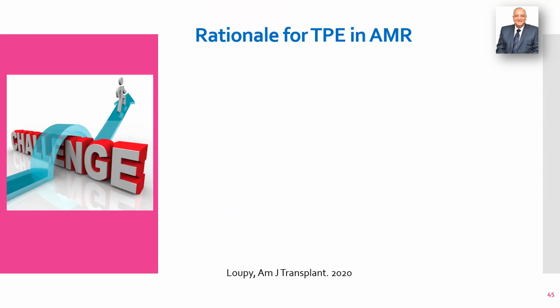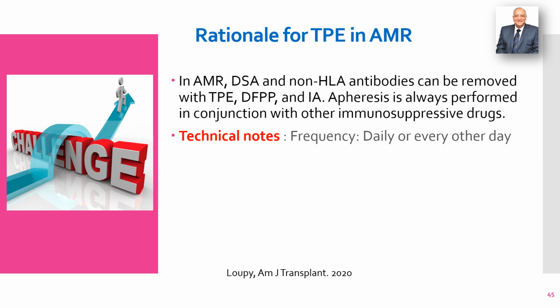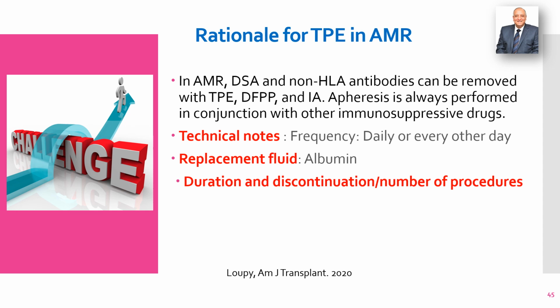Lastly, plasma exchange in antibody-mediated rejection. Both DSA and non-HLA antibodies can be removed with plasma exchange, double filtration, or immune adsorption. Apheresis is always performed in conjunction with other immunosuppressive drugs. It may be daily or every other day, and the replacement with albumin.